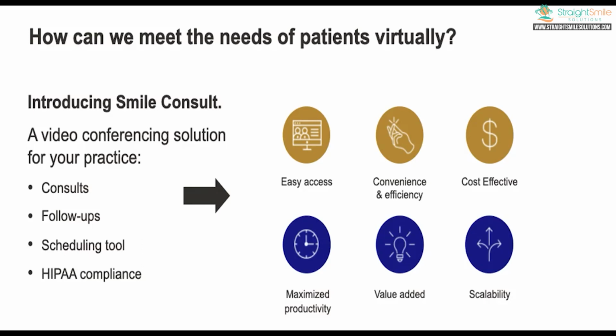So if you're seeing ClearCorrect patients, or you're doing white label aligners, or you're doing braces or phase 1 or anything else, you can't use this technology with that. But let's go over it. There's really nothing brilliant that goes into what they're doing. This is stuff that I've been doing with my clients for years already. It just so happens to be neatly packaged, and it does have AI that integrates with the Align Technology portal. So basically, you got your Smile Consult. I believe it's an app.